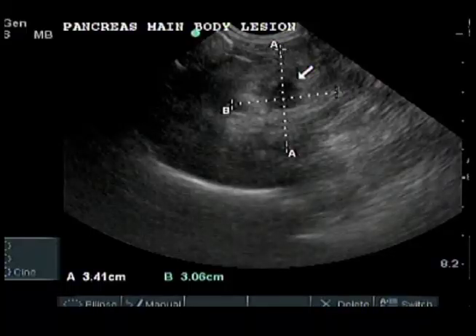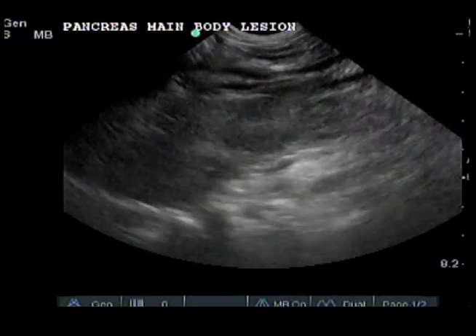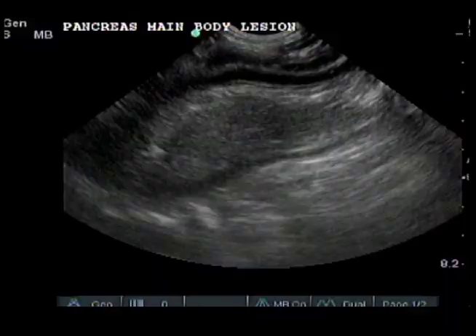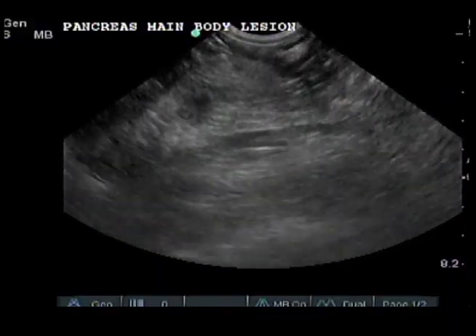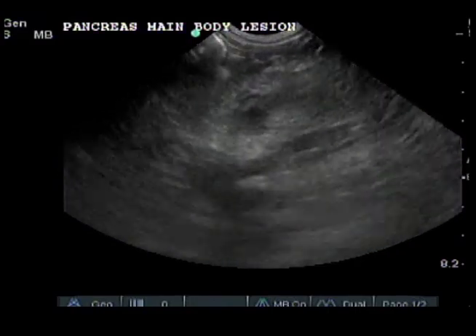You have just seen a visual review of a general abdominal scan to help refine your visual skills. Each organ was taken from different animals in actual case studies. The images were presented in real time and in the order I prefer to follow for a general abdominal scan.